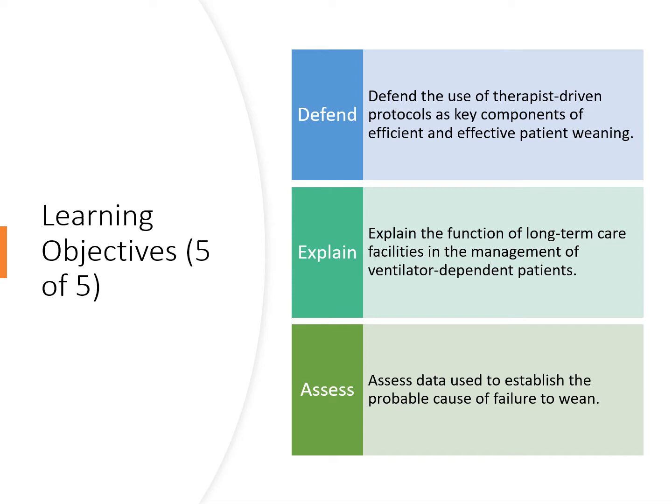We don't have to wait for a doctor to drive in, or we don't have to wait for a whole other process to go down before we can do this. Therapist-driven weaning is something that can be initiated safely and really does help give that patient the highest quality of care when done with evidence-based practice.